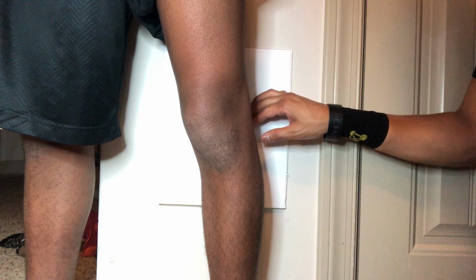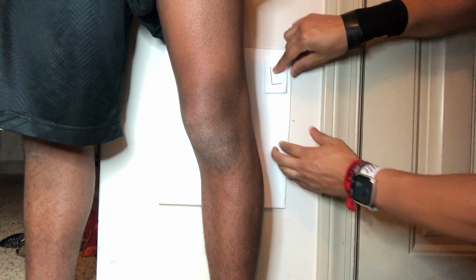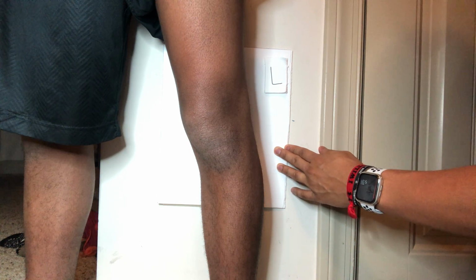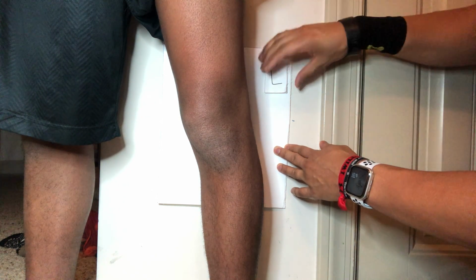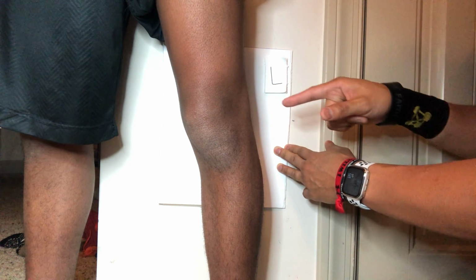We're going to shield the patient, and we're going to ask the patient not to breathe and not to move as we take this image. This is the left knee, so we would put the marker on the left side of the image receptor for the AP knee. If we were doing this recumbently, it would be the same procedure, except we would have a tube angle of 2 to 3 degrees in order to capture the projection.